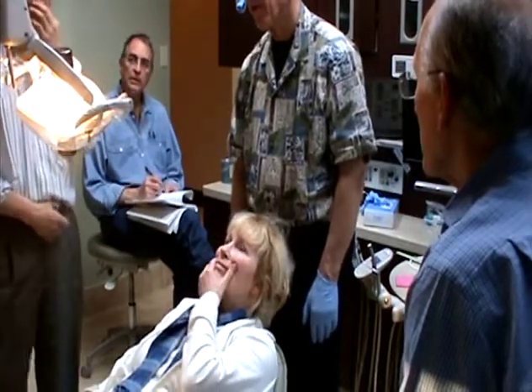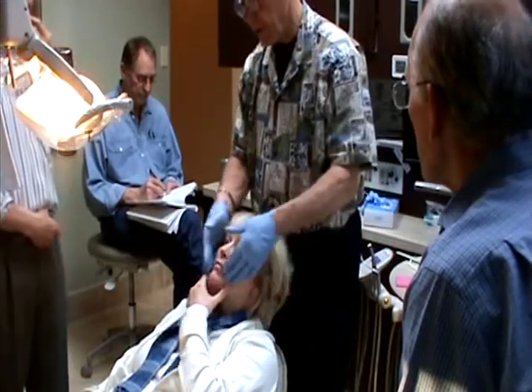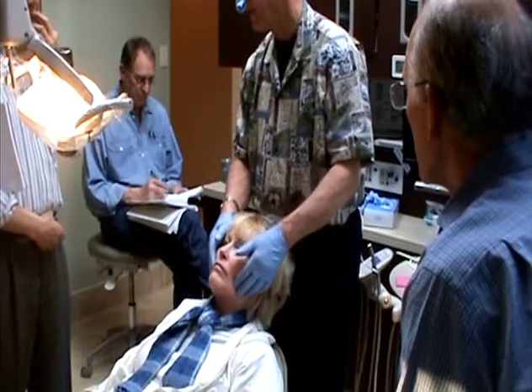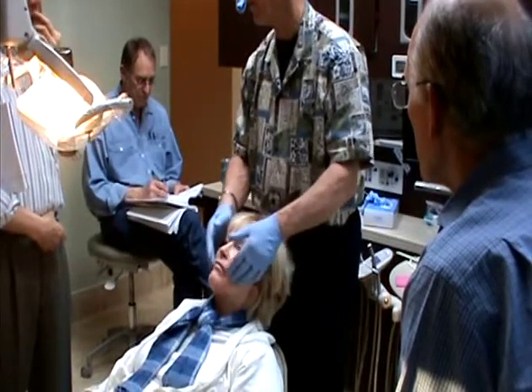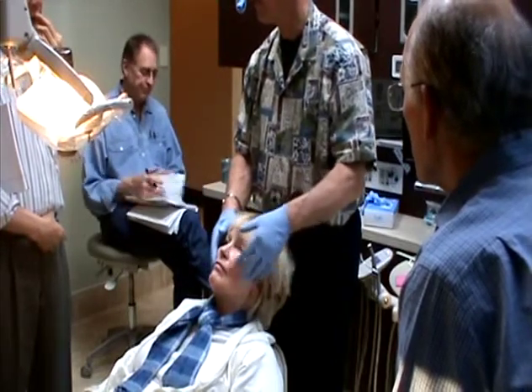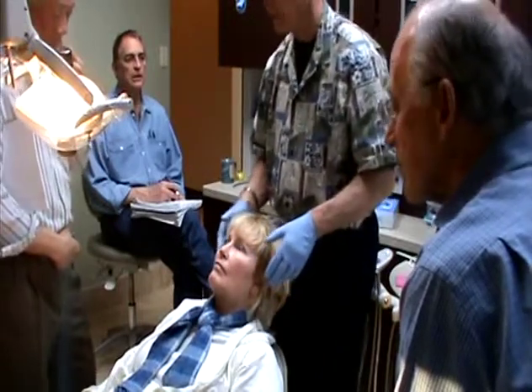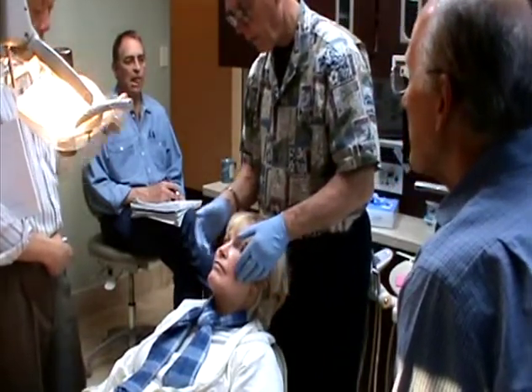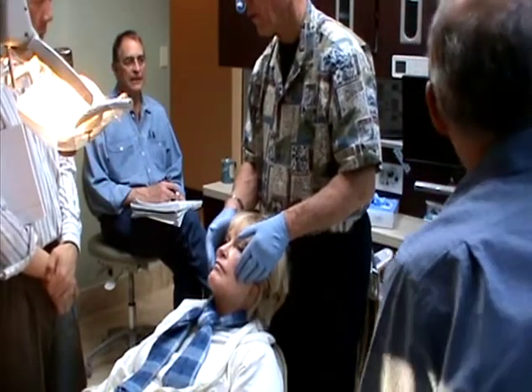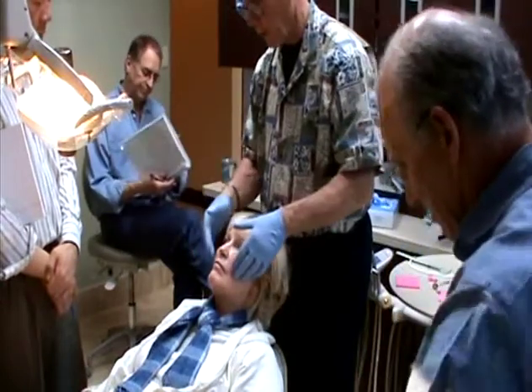The only trouble with doing them both at the same time is that when you put the elastics in here and you've got this expanding, the elastics are going to pull this expansion farther, faster. So I would do the upper, keep a good wire in here to keep this lock, get the upper out where it belongs. Well, you've got equal and opposite forces. Now you've got elastics through the buckle, through elastics to the lingual.